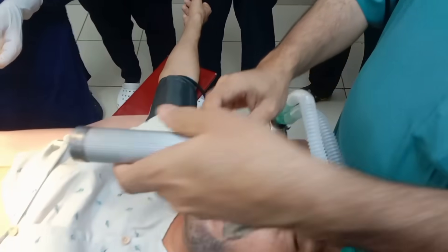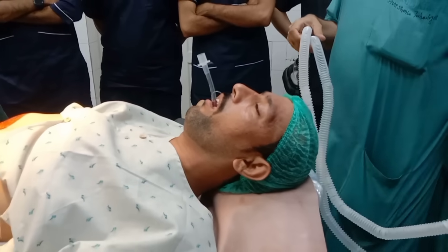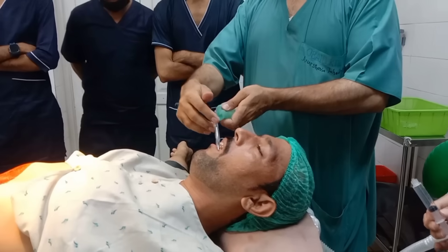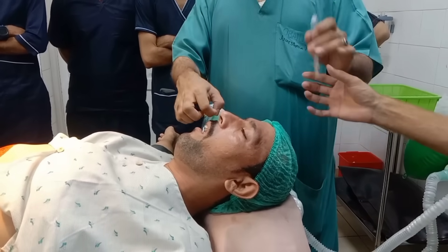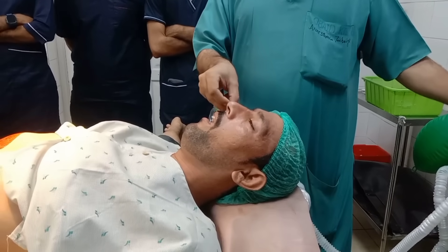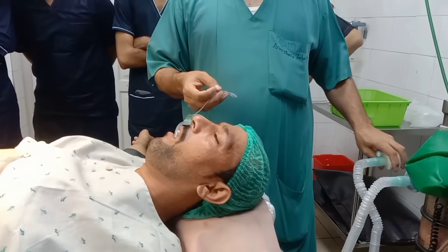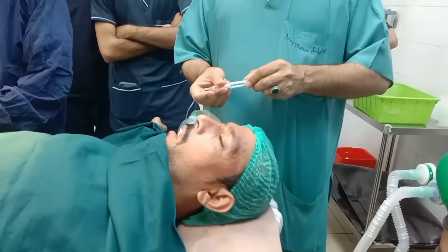Endotracheal intubation. Using a laryngoscope, I carefully visualized the vocal cords and passed the endotracheal tube into the trachea. After inserting the tube, I confirmed its correct placement by observing chest rise, auscultating bilateral breath sounds with a stethoscope, and checking the capnography waveform. Once confirmed, I secured the tube firmly with tape.